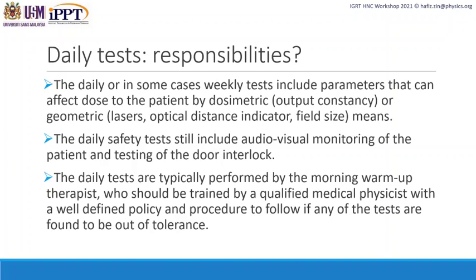So the daily test includes parameters that can affect the dose to the patient by either dosimetry or geometric means. So dosimetry is usually referring to the beam output constancy, whereas geometry is referring to the lasers, optical distance indicator, and also the field size.